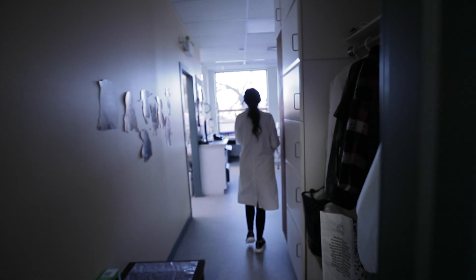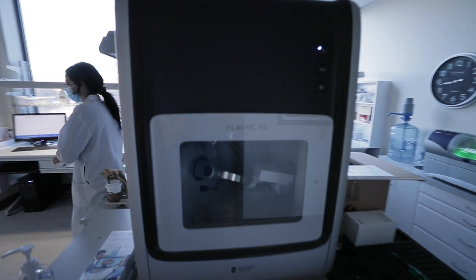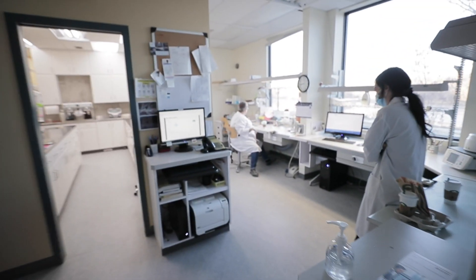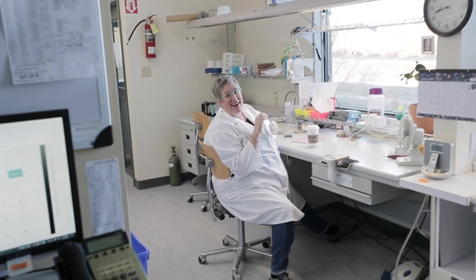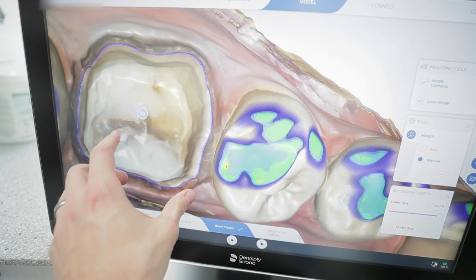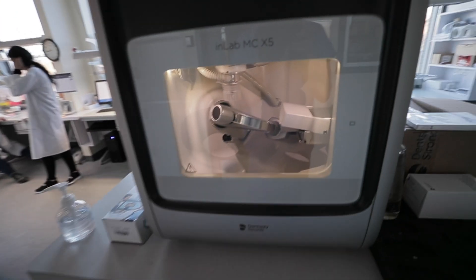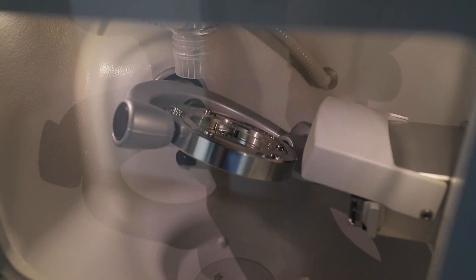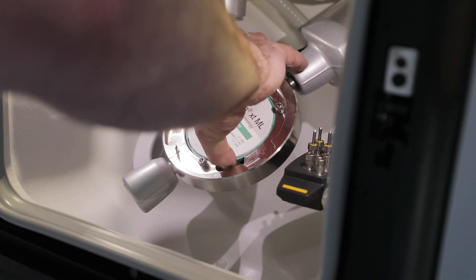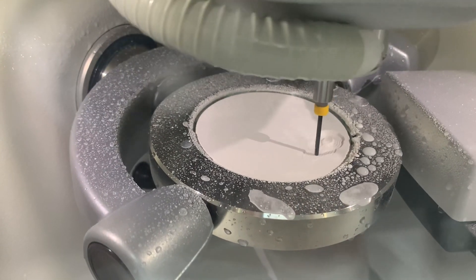It's Christmas morning! Look at this beast! Once we're done scanning upstairs, we send the information down here to the lab where we have these ladies who make our crowns and many other things. It gets sent digitally to this machine — a five-axis milling machine — where they take a block of porcelain. There are tiny mini drills all set up in here that go ahead and mill that block of porcelain out into the perfect shape.